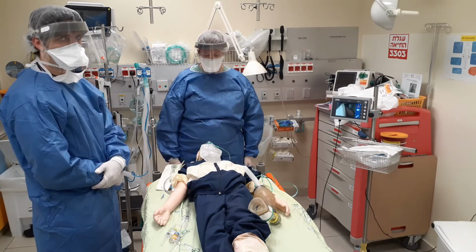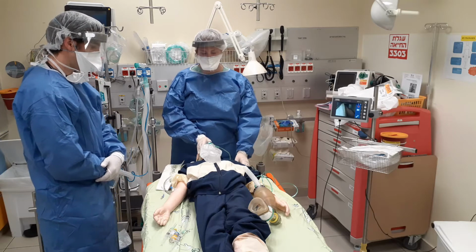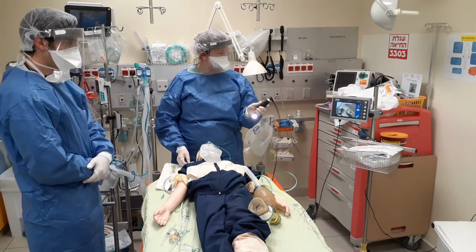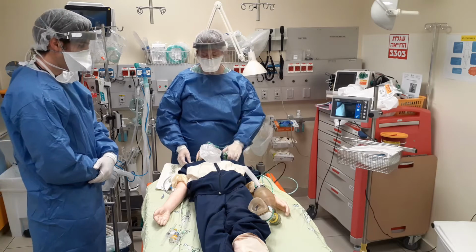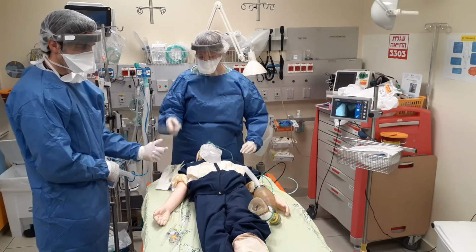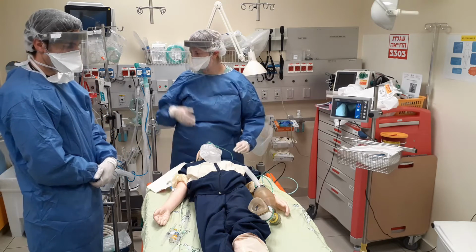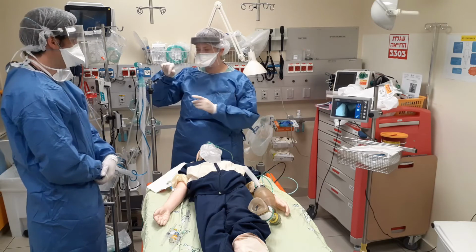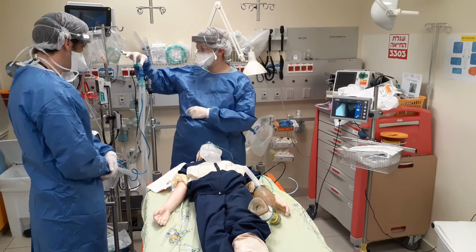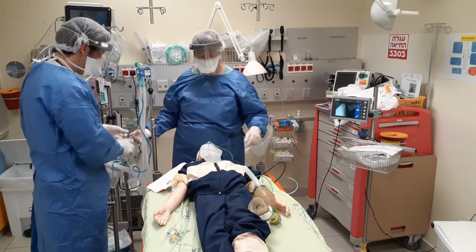Stage 3. Make sure you have all the available equipment. A 100% oxygen non-rebreather mask, a video laryngoscope as a primary option, a regular laryngoscope as a secondary option, an ET tube, the correct size for the patient, and an LMA if the intubation is unsuccessful. In addition, we should have a suction catheter and device, and a ventilator with an ET CO2 sensor on hand.